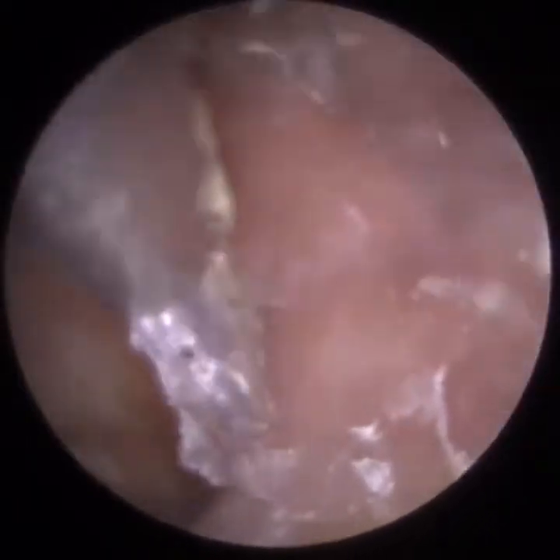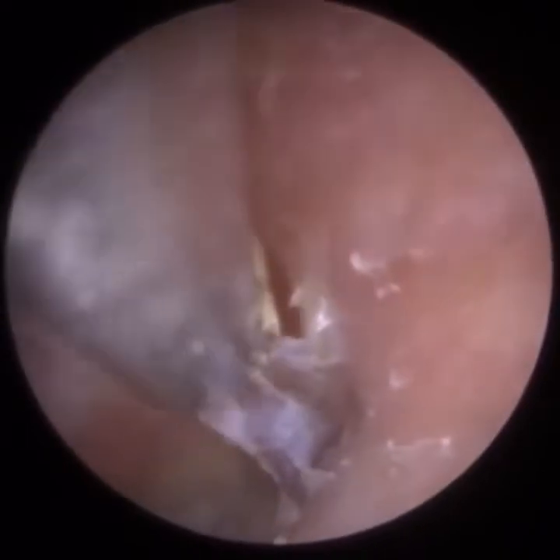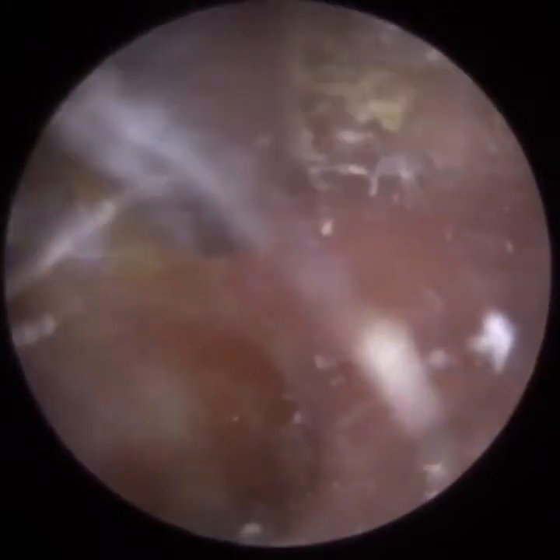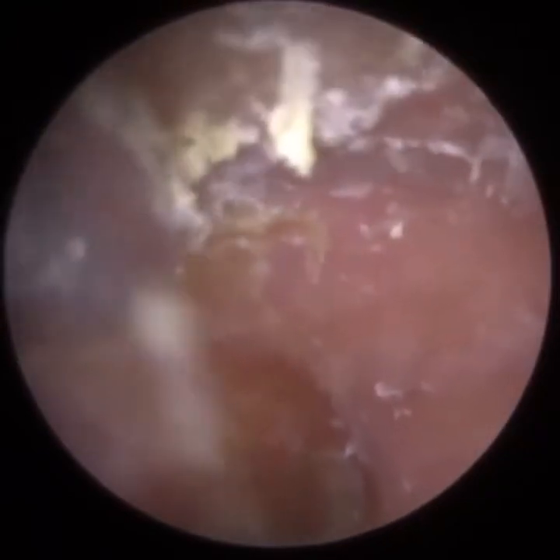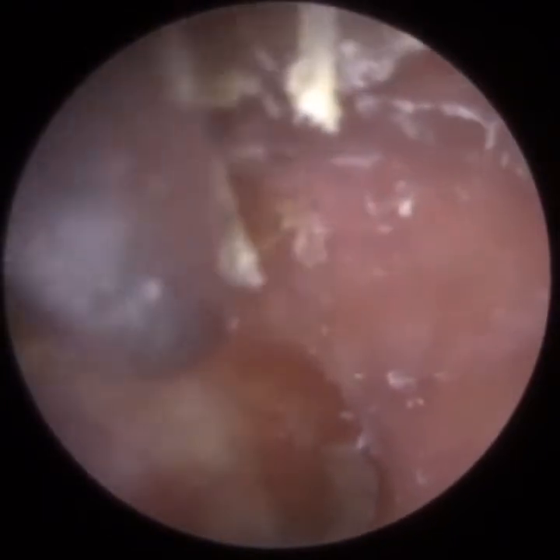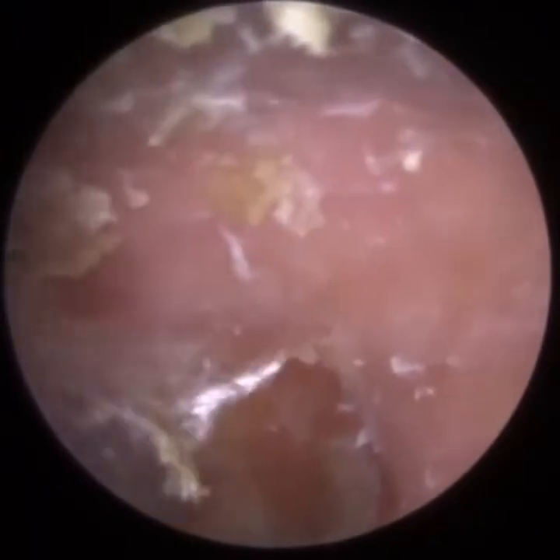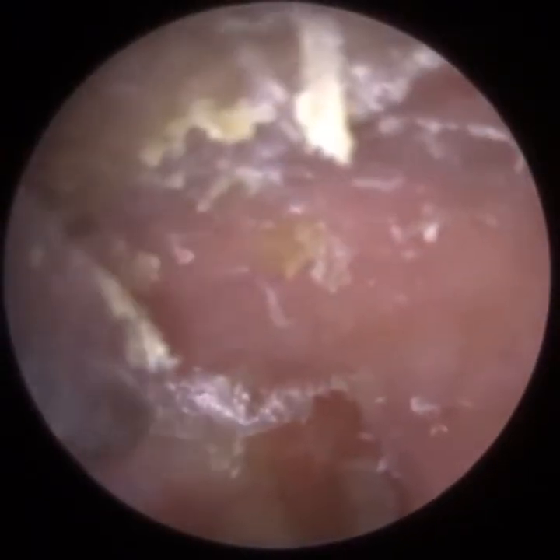Just peeling this forwards all the way to immediately towards the eardrum again. So slowly you can see what we've done, layer by layer. We're removing this dead skin, and we're going to see the flesh of the ear canal now. Again, just at the roof of the ear canal. The skin that I'm on now is still on the eardrum.